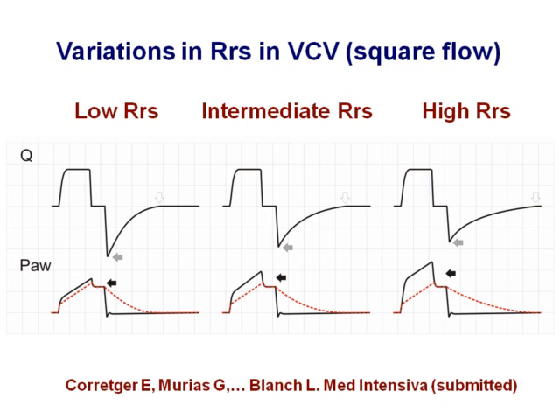You will see here how, with an increase of resistance, there is a problem in the exhalation, because due to the high resistance the time constant is prolonged, and we get all the preceding tidal volume expired here in the middle of expiration, whereas here we need a longer expiratory time. So again, the combination of these two.